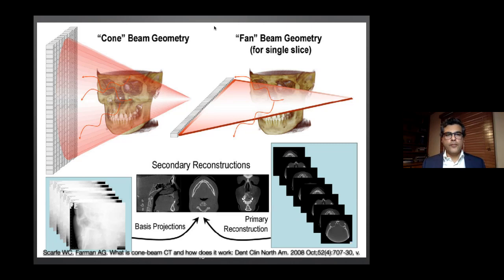On the other side, conventional CT scanners have a much smaller detector. The newer ones have up to 64 individual slices stacked on top of each other, so they are now able to produce images pretty much as fast as cone beam CT. But traditionally, the gantry has to rotate around the patient's head multiple times to acquire a region of interest or part of the patient's anatomy.